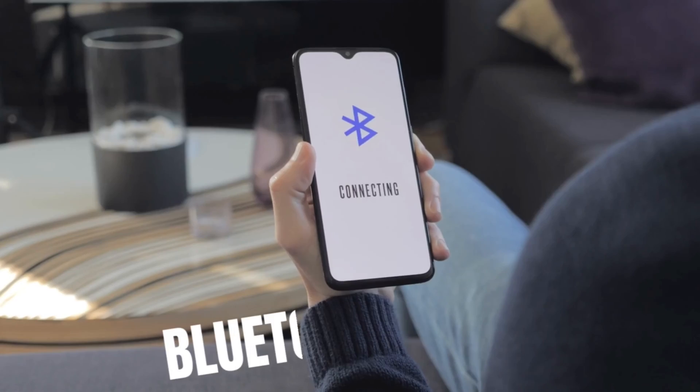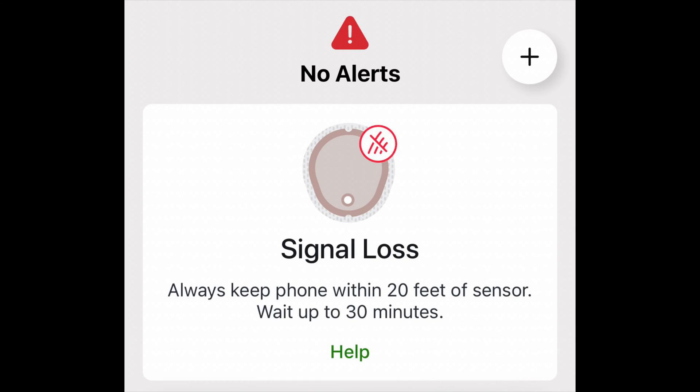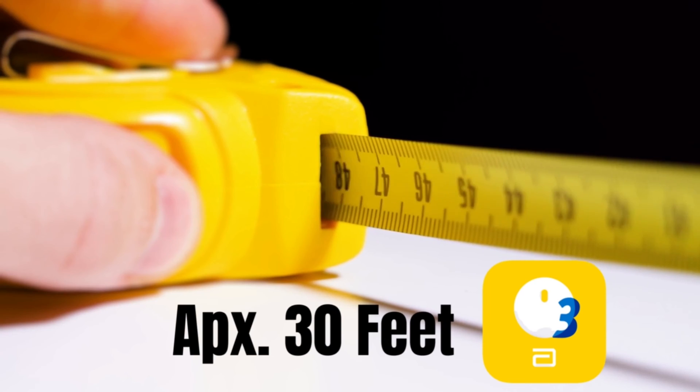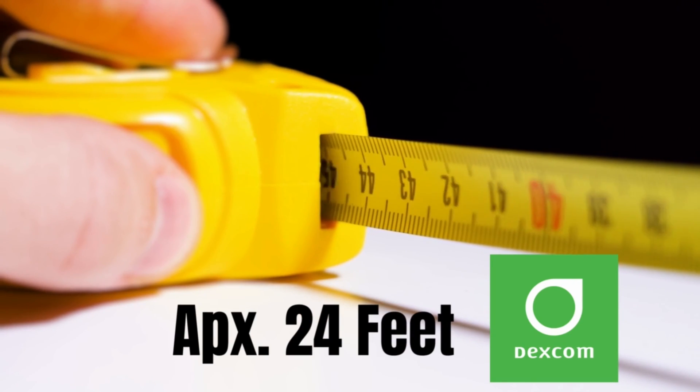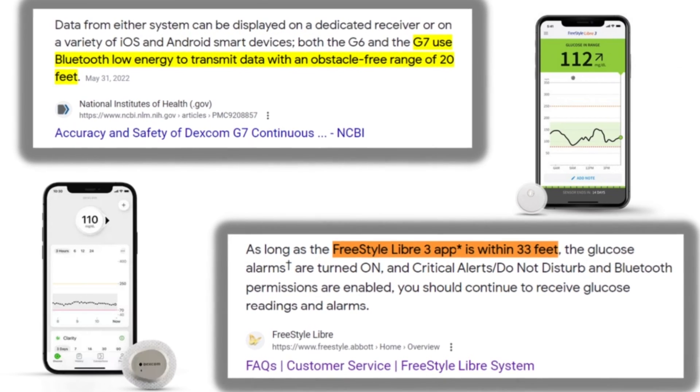I also tested the Bluetooth range — how far can you walk from your phone before getting the dreaded sensor out-of-range alarm? The Libre sensor with no obstructions outdoors maintained connection up to just over 30 feet away from my phone, whereas the Dexcom G7 lost connectivity at about 24 feet. This is very similar to the reported Bluetooth ranges listed on the official websites for both companies.